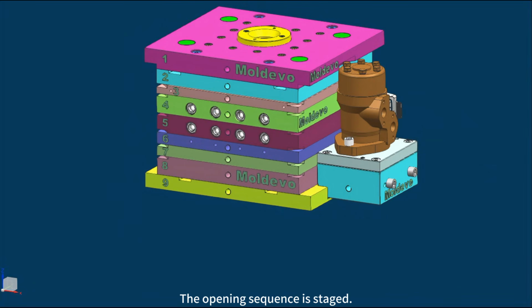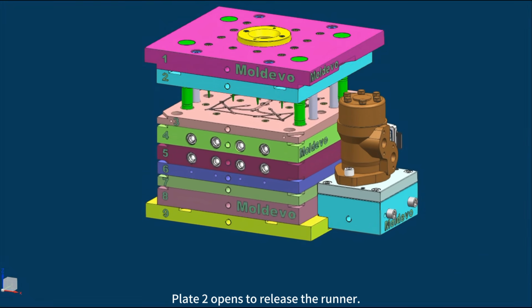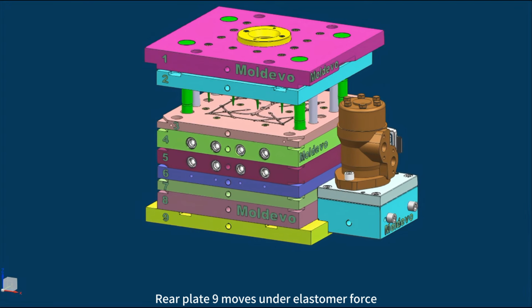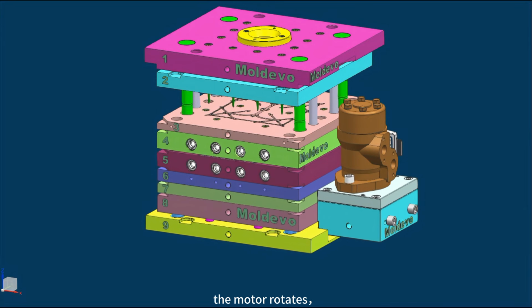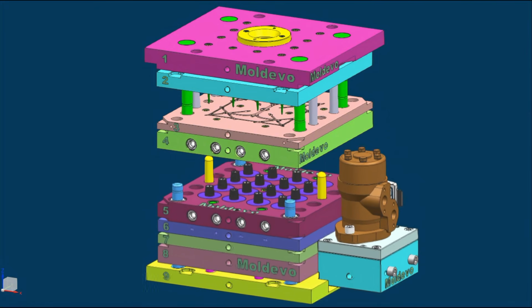The opening sequence is staged. Front plate 3 separates first. Plate 2 opens to release the runner. Rear plate 9 moves under elastomer force to create clearance for the threaded inserts. Then plates 4 and 5 separate. The motor rotates, and the threaded inserts retract.